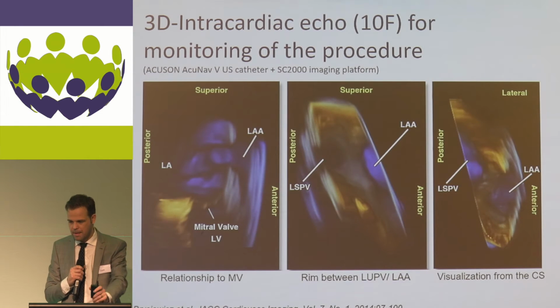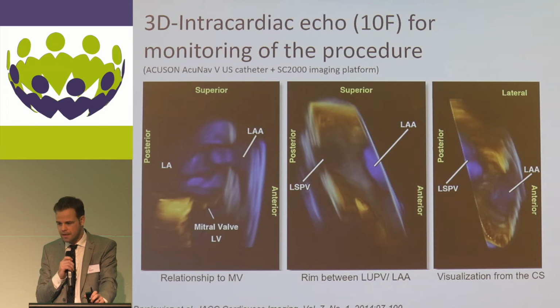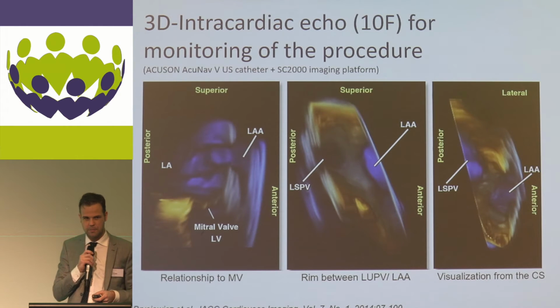And it might even be better when we switch to 3D, but this is what the images Nina showed 2 years ago. The volume size is quite small, so I think it's 3D, but it's more like a fixed slab at the moment. So that was a big problem.